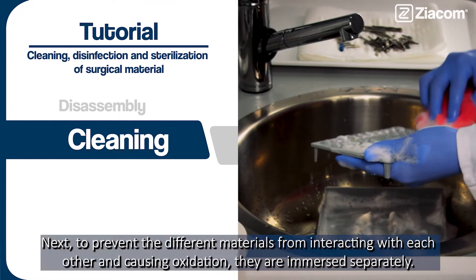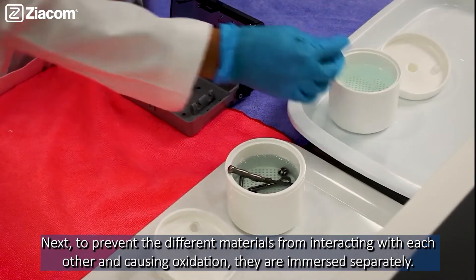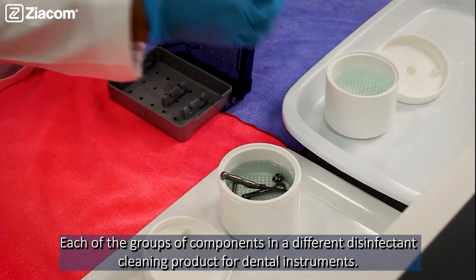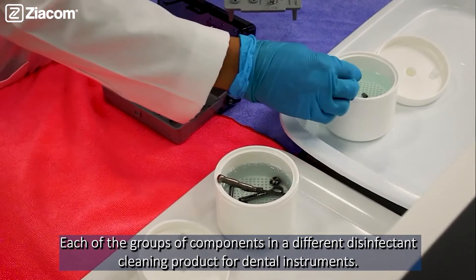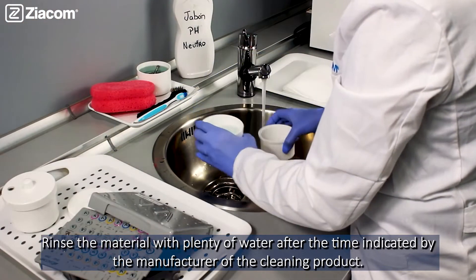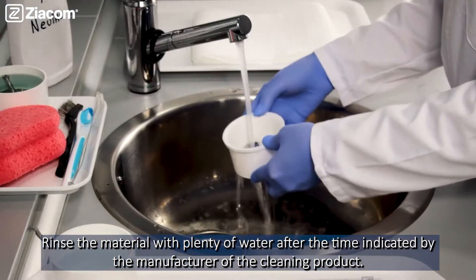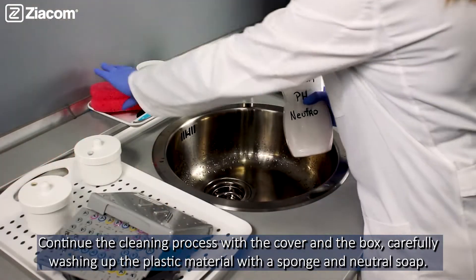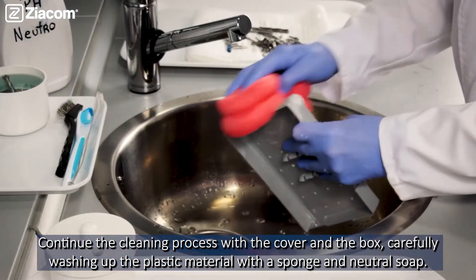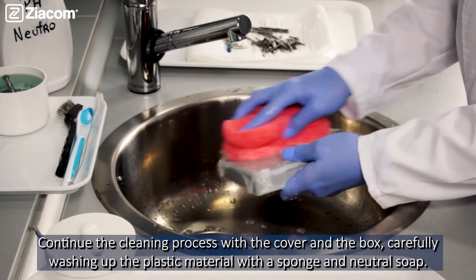Next, to prevent the different materials from interacting with each other and causing oxidation, they are immersed separately. Each group of components is placed in a different disinfectant cleaning product for dental instruments. Then, rinse the material with plenty of water after the time indicated by the manufacturer. Continue the cleaning process with the cover and the box, carefully washing the plastic material with a sponge and a neutral soap.